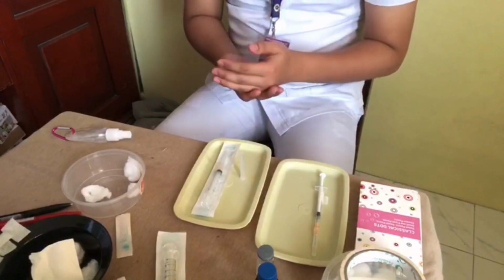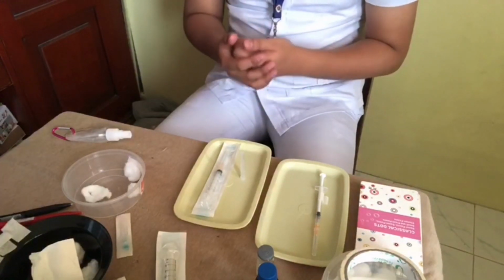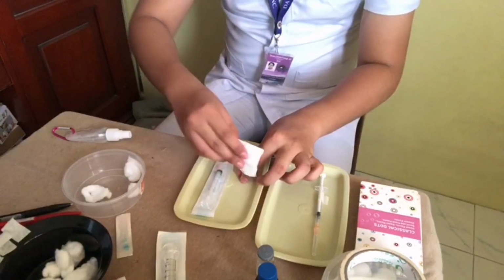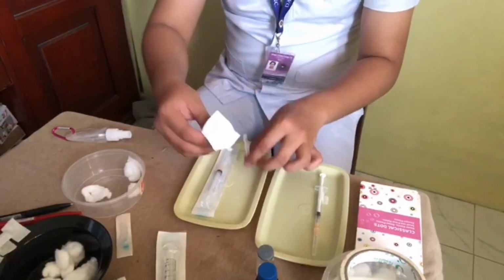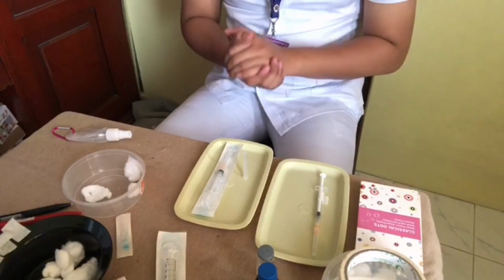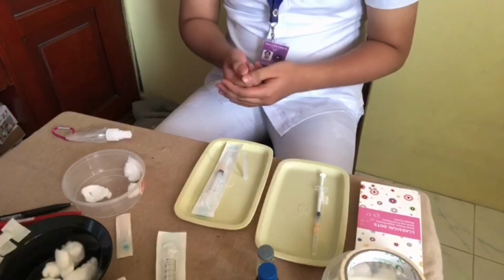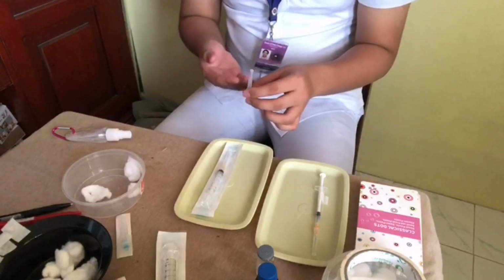And then place a piece of sterile gauze pad or alcohol wipe around the ampule neck. Okay, I'm going to get the gauze pad and then wipe the neck and around the neck. After that, discard the gauze pad, and then place the antiseptic wipe back over the top of the ampule before breaking off the top. Break off the top, making sure to bend it away to avoid getting broken fragments on others.